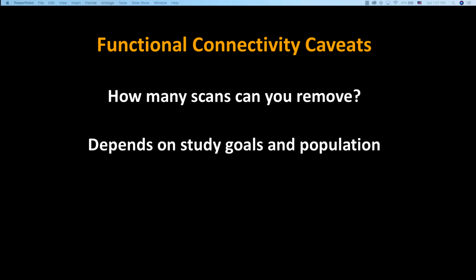Now, recently there has been something called FIRMM, F-I-R-M-M, from Damien Fair, his lab, and some other people. And this is a way to collect resting state data as the subject is being scanned. Has anybody used it here? It's called FIRMM. Yeah, you've used it, yeah. How does it, I'm curious, does it seem to work pretty well? We are just starting this a month ago, but no one actually used it for a scan time. Oh, okay. Yeah, that's their major point. So you set up a longer time and you stop if you have enough.